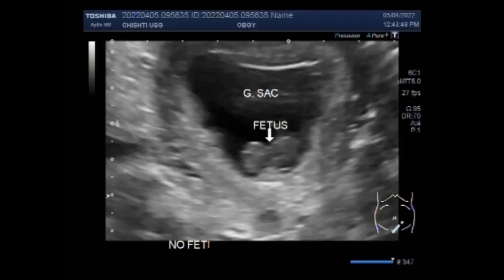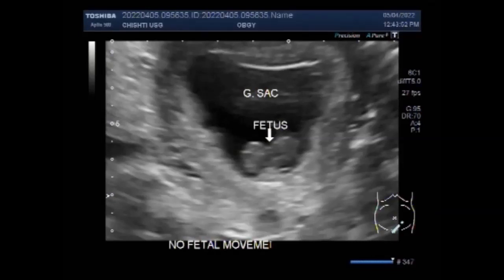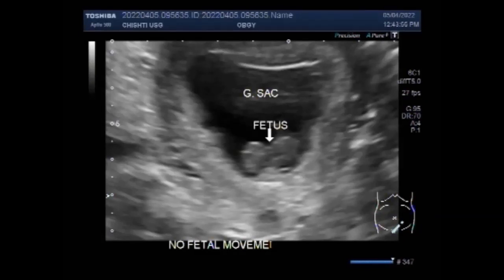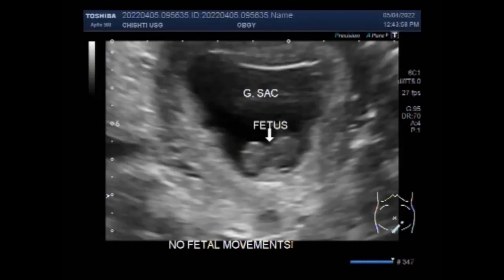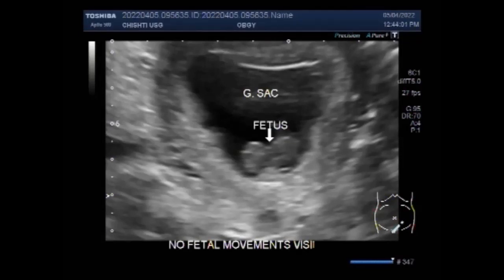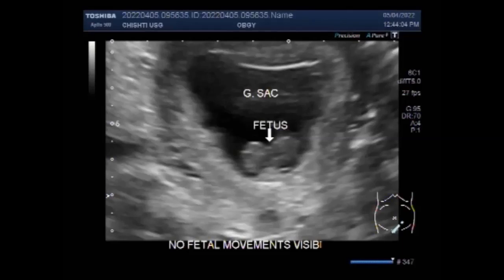Transvaginal ultrasound is the mainstay in the diagnosis of miscarriage. You can see this fetus has no fetal movements, there is no fetal blood flow, and fetal cardiac activity is also not seen.